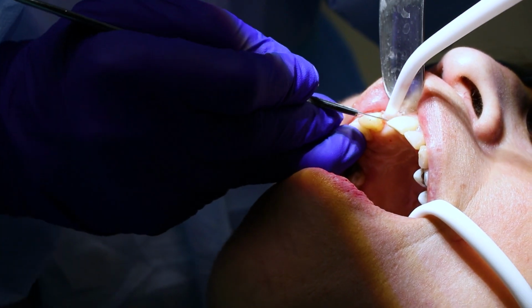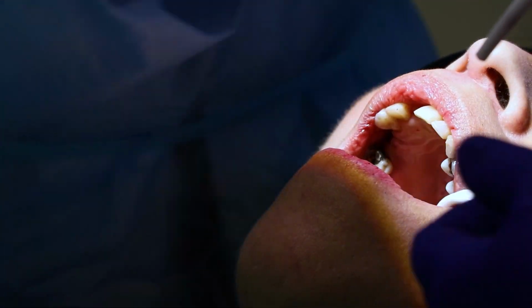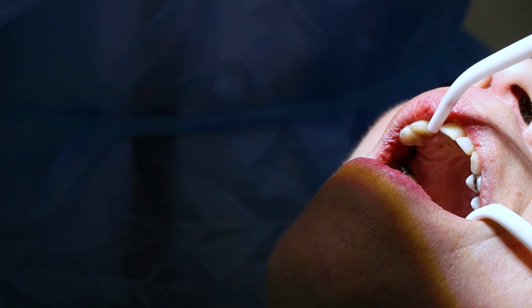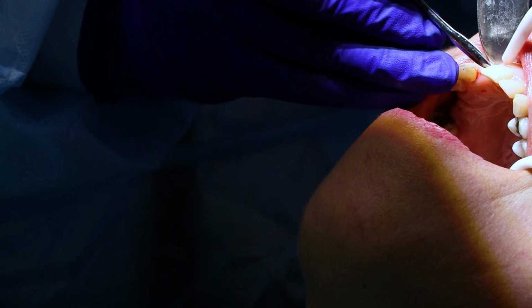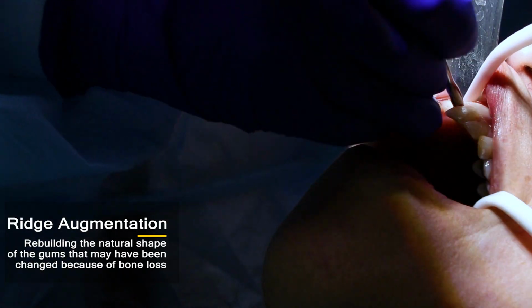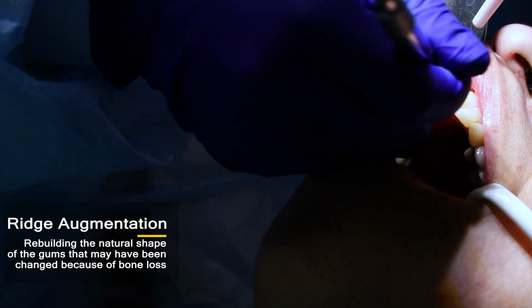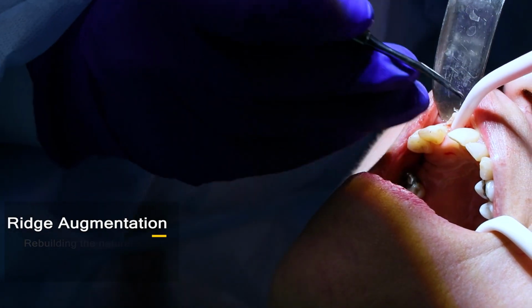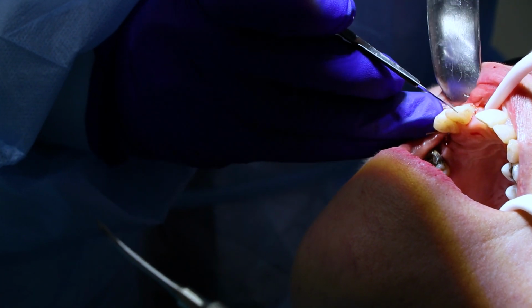So in this procedure, what we're doing is basically once I numb the patient, she only has about 2 millimeters of bone, and I saw this in the CT scan before, so we advised her she needs a bone graft. This is called a ridge augmentation, and the procedure is technique sensitive but fairly simple to understand. So basically the gums are elevated and the space is made for the bone graft.